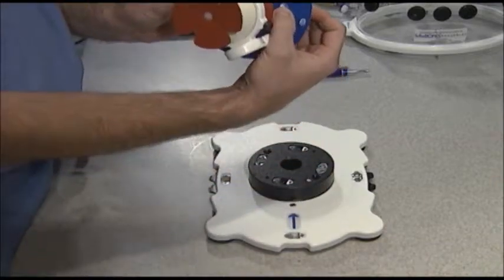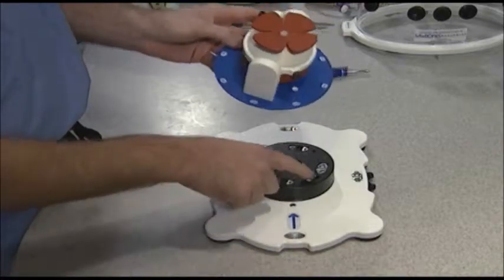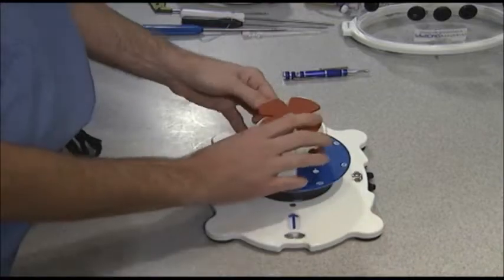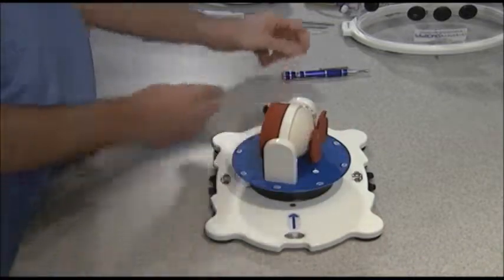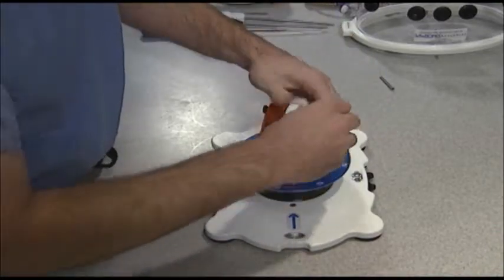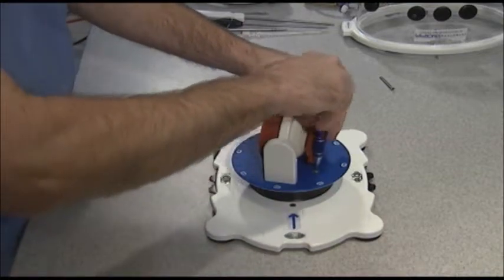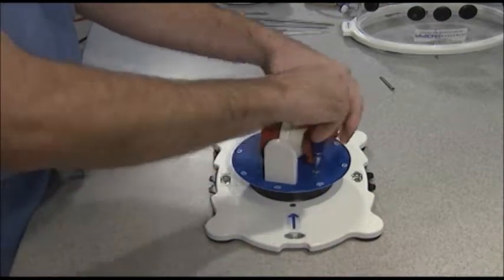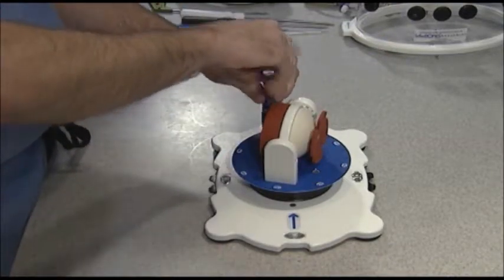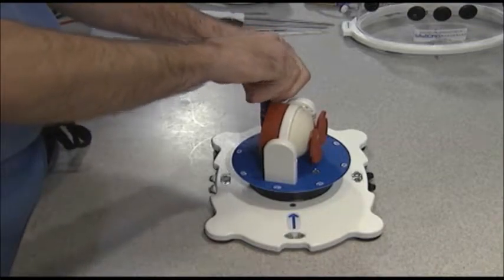Then you want to look at these two little holes here, one here and then one on the other side. These need to line up with the holes for the screws that are in the base. You put that down, and then you need to flip the module in order to actually insert the screws into the position. The reason that we screw this down is that if you're using a mallet for a punch or twisting hard to get a bite with your anchor, you can sometimes dislodge the module, and so it's best to have it screwed into the base station.